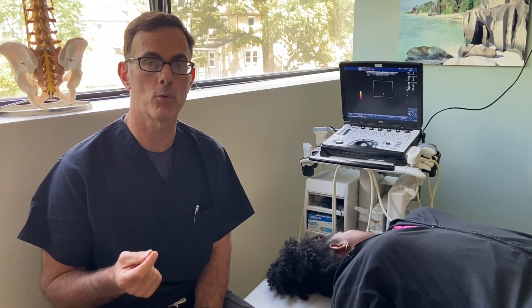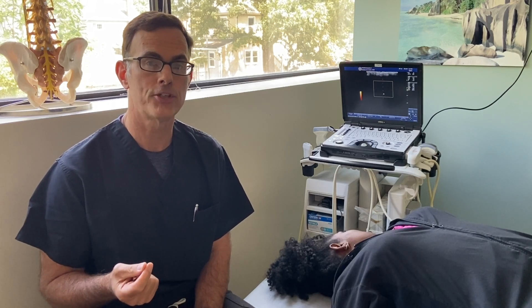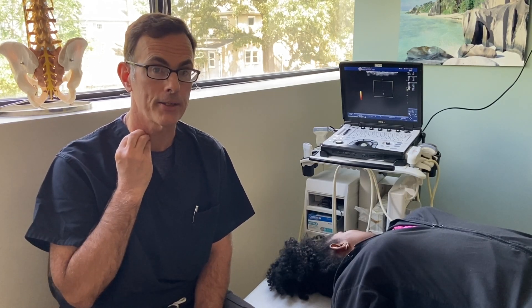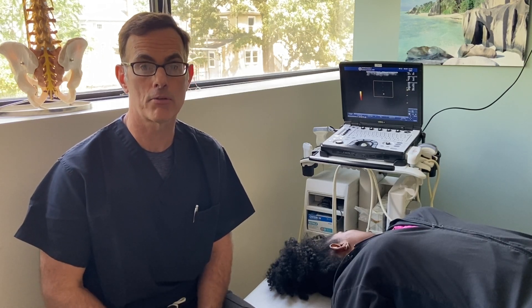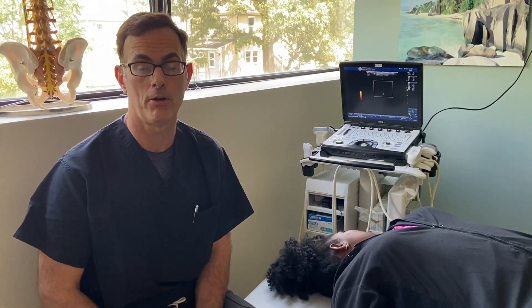Primarily, ultrasound provides wonderful imaging with very great detail to see all soft tissue structures in that field of view. This is important because there are some very important structures that lie in the area of the stellate ganglion, such as blood vessels, nerves, your thyroid gland, esophagus, and other things. You're not able to see these on fluoroscopy, but you can see them very clearly on ultrasound.